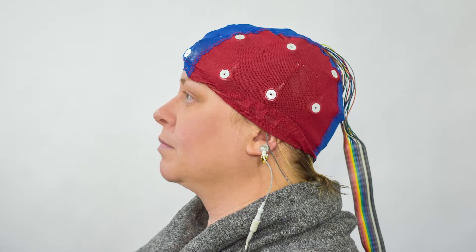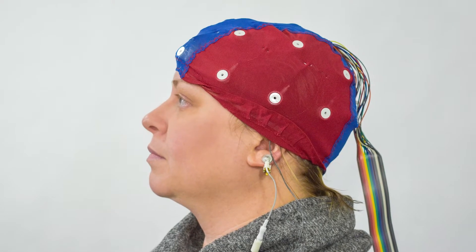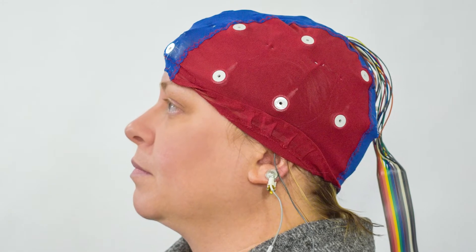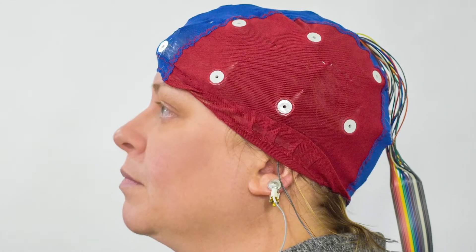We can also put them in a cap, a swim cap that a person wears on top of their head that has the spacing predetermined so the correct placement is on the head.